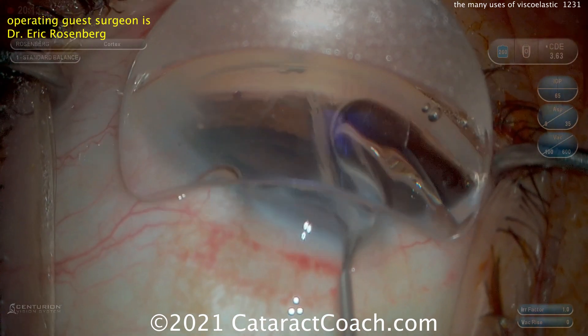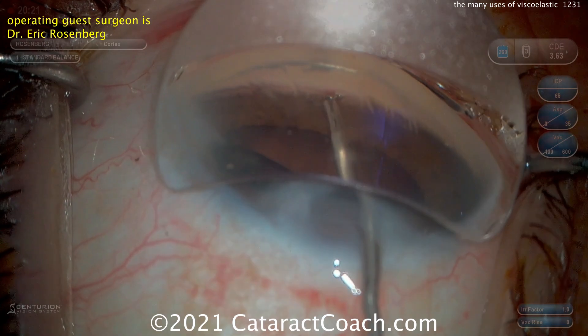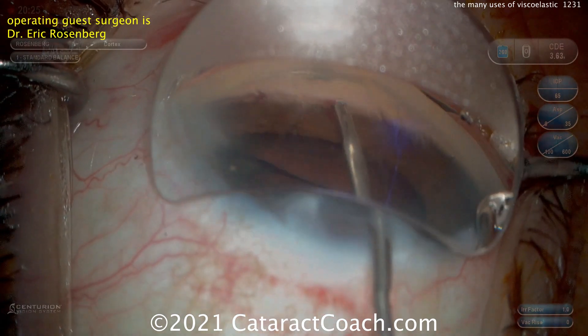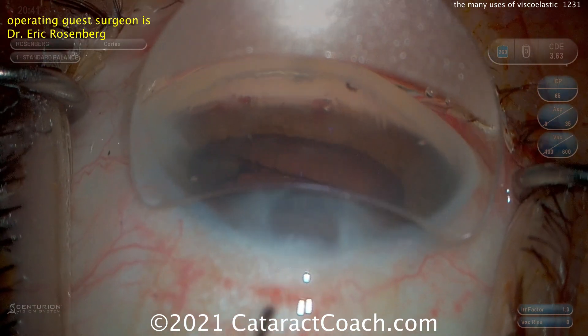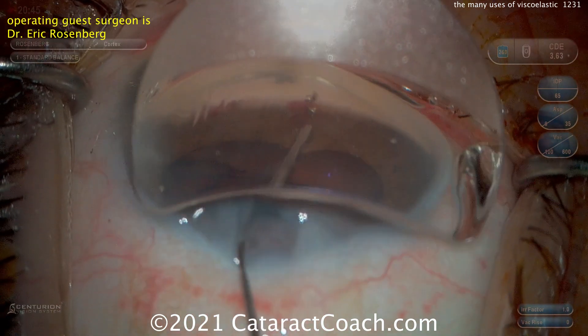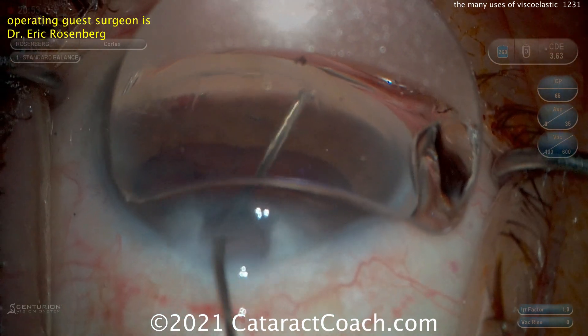It goes in, but we're losing our view a little bit in the gonio mirror there. And that's not well placed — uh-oh. So what do you do now? It's not well placed at all. You can't just push it back into position, it's not going to work there.